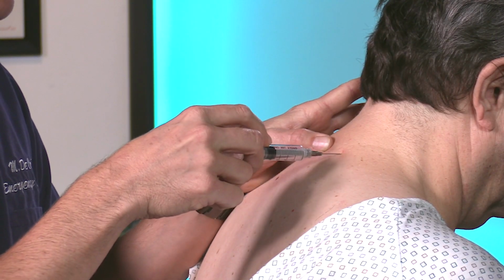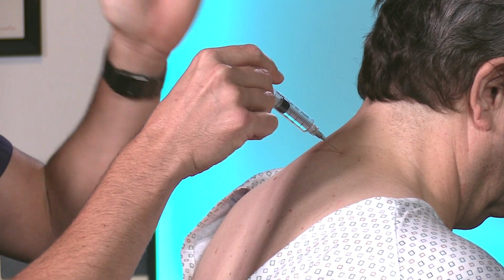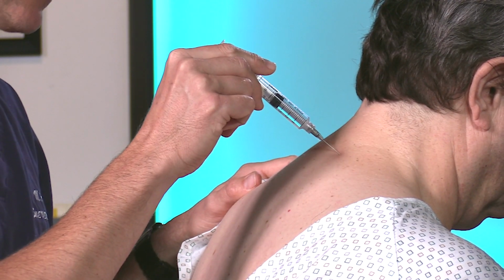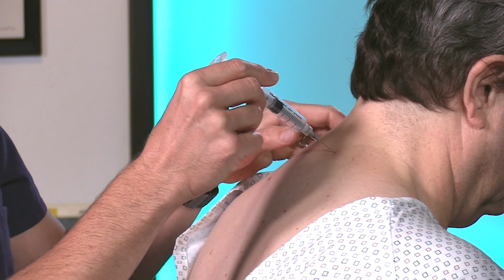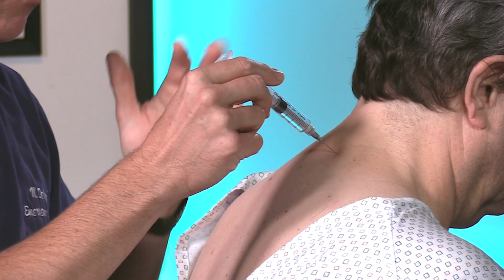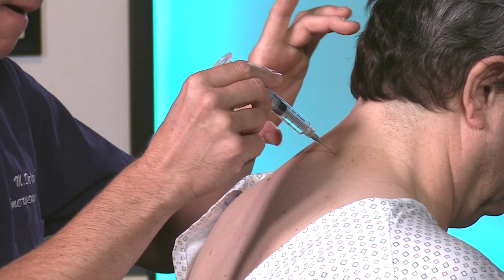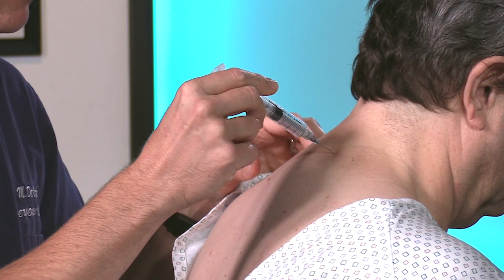And then you want to take your needle and you're going straight into the musculature of the neck. You're not going towards the spinous process. You're not going laterally. You're not going up. You're not going down. You just want to make that nice 90-degree angle on that plane and imagine you're going straight in. People sometimes get worried, oh, what if I go into the spinal cord? You can't. The needle's too short and the spinal cord is behind bone in the midline. All you have here is really your trapezius and more musculature.